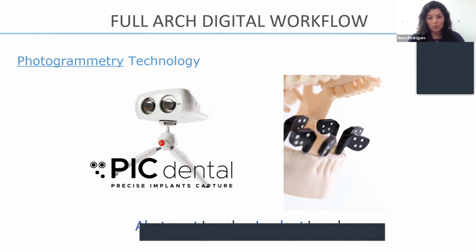That is, I think, super cool because even with the smart system, they were able to create the analogs for my model creator, since I already was using the smart system for my immediate conversions. They were able to create my analogs digitally for me to relate and use on my designs with my PIC scanner. So that is really cool from them as a company.